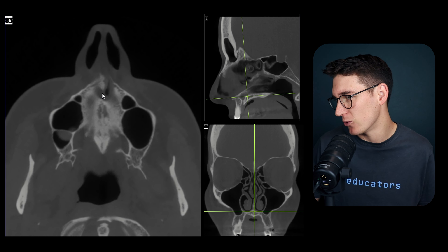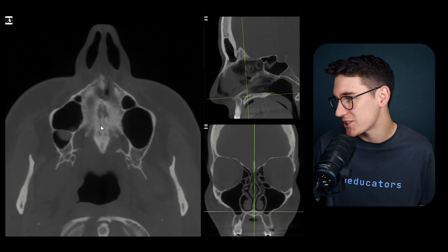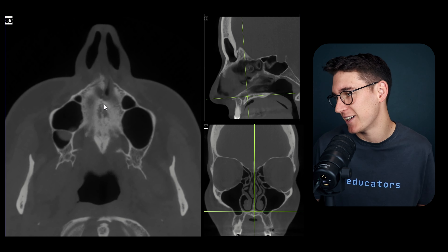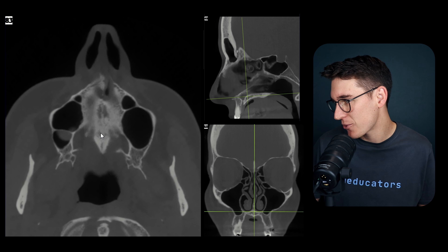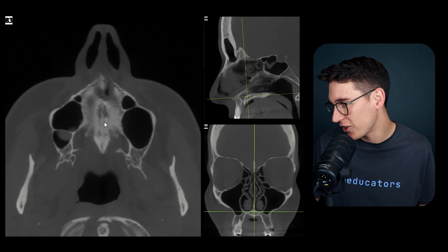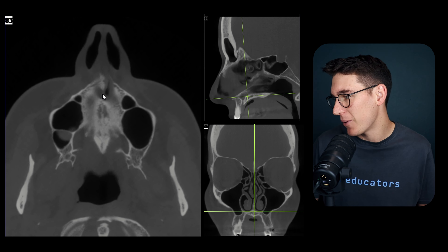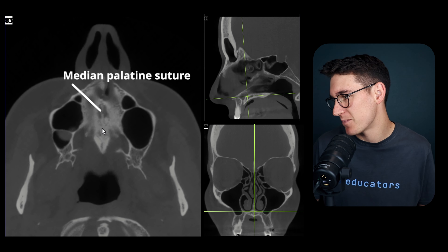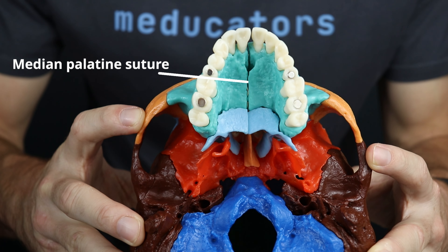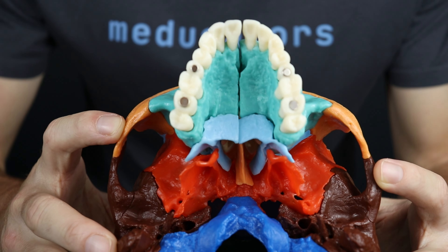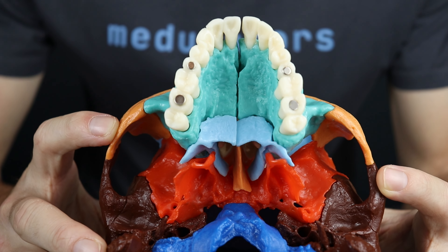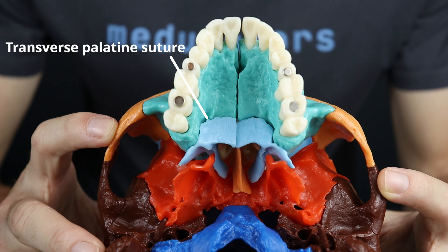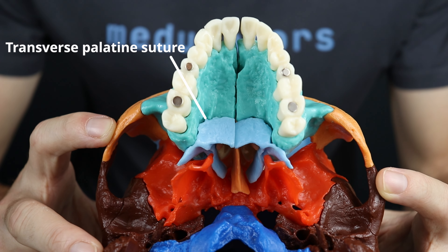The palatine process of the maxilla is separated along its midline by the median palatine suture. The palatine process is separated from the palatine bone by the transverse palatine suture.